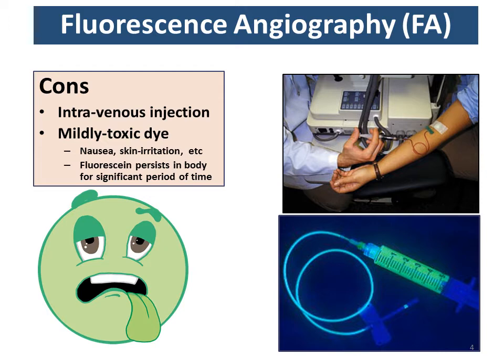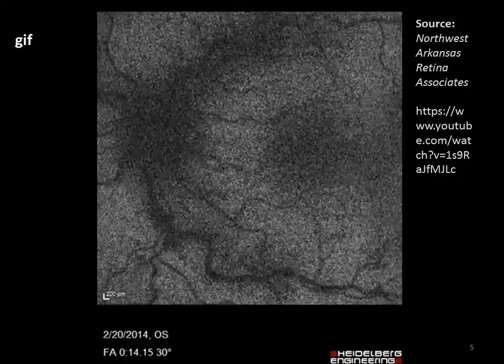The other thing is that the fluorescent dye remains in the circulation for quite some time before being filtered out by the kidneys. And I haven't undergone a fluorescence angiography, but I've been reliably informed that it's quite an unpleasant thing to go through. If you could avoid it, you'd rather not. But it does give very nice results.